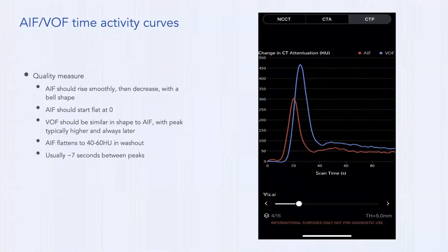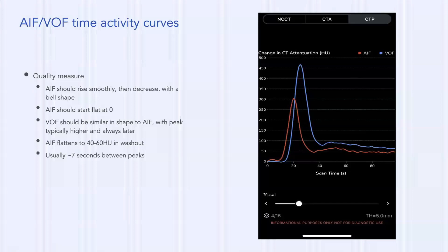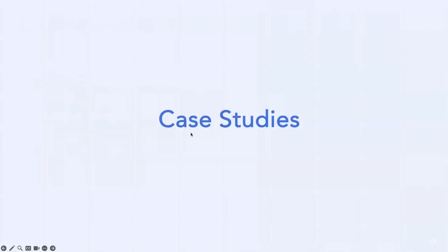Look at the activity curves — you want to see two peaks: the arterial peak and a later, denser venous peak. The difference between the two peaks is usually about seven seconds or less. If it's expanded and longer, there may be a problem between the arterial and venous phases.